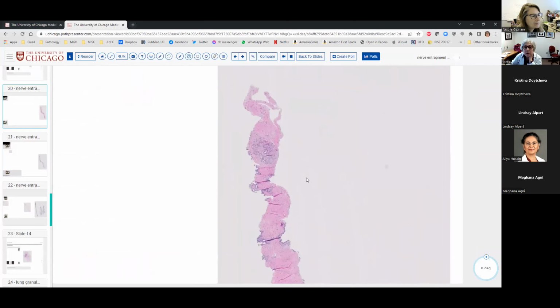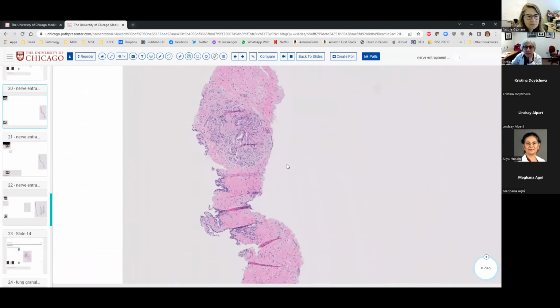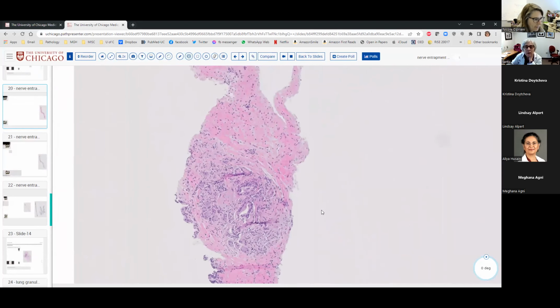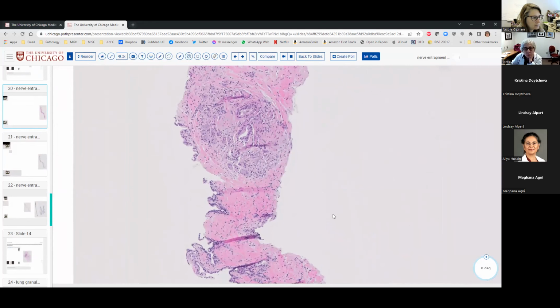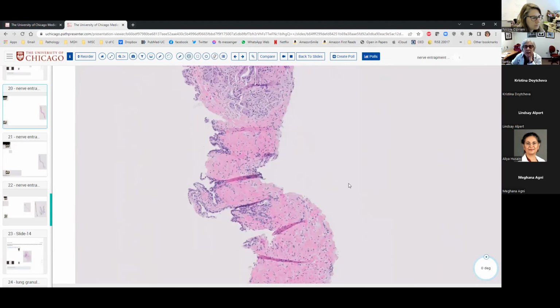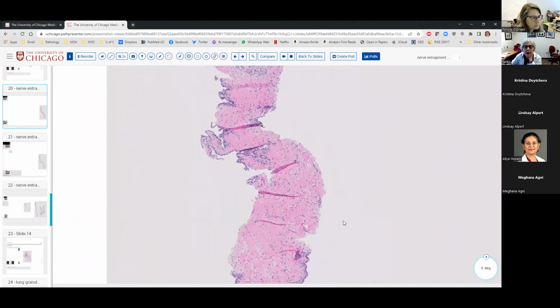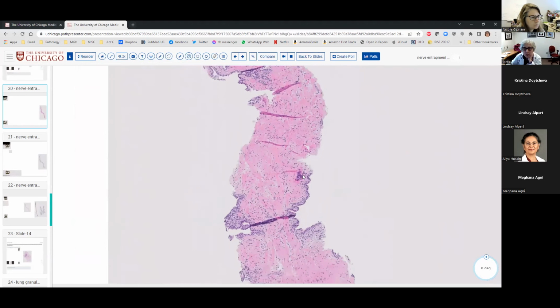This is obviously a prostate biopsy. We see a nice core. And as I always point out, when you are looking at a prostate biopsy, you tend to do that on low power, trying to assess, is the architecture normal, which means there are groups of glands forming almost like a lobular structure, and then there's enough stroma in between.